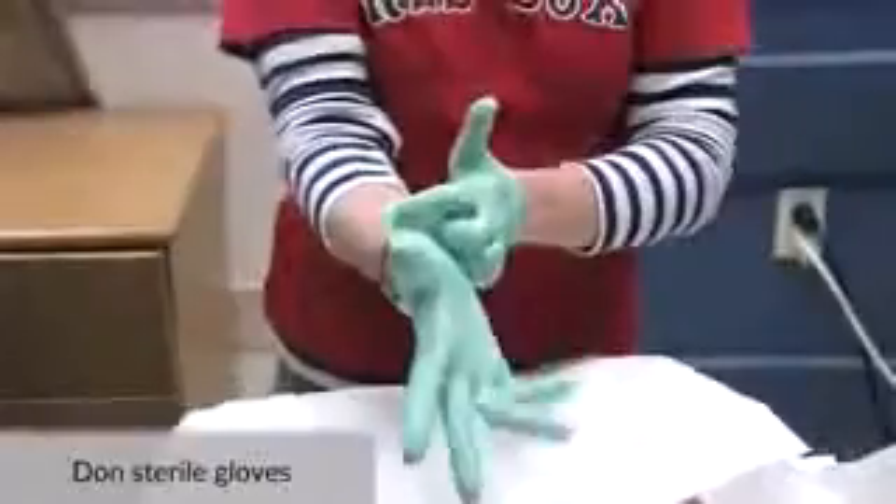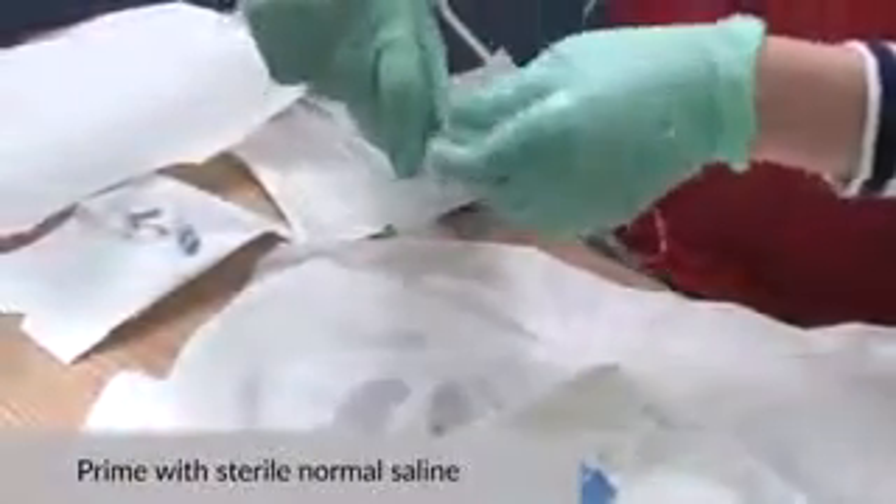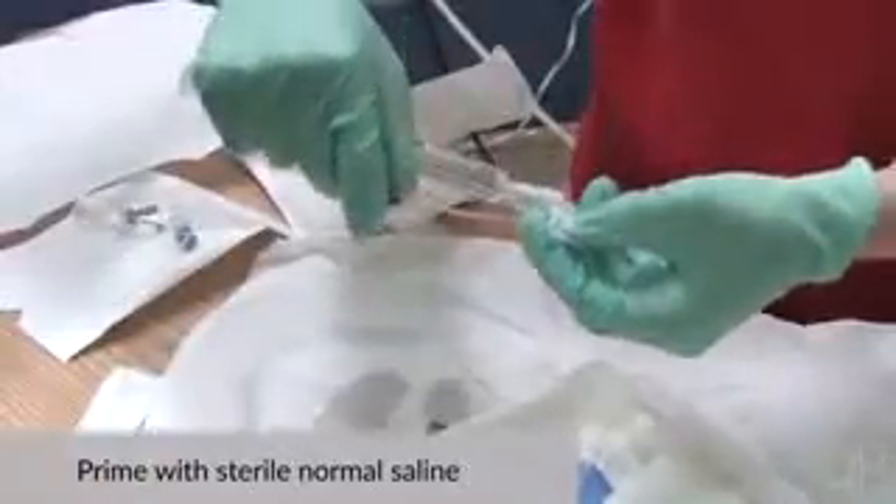Don sterile gloves. Attach the needleless connector to the needle set and prime with sterile normal saline. Close the clamp and return it to your sterile field.